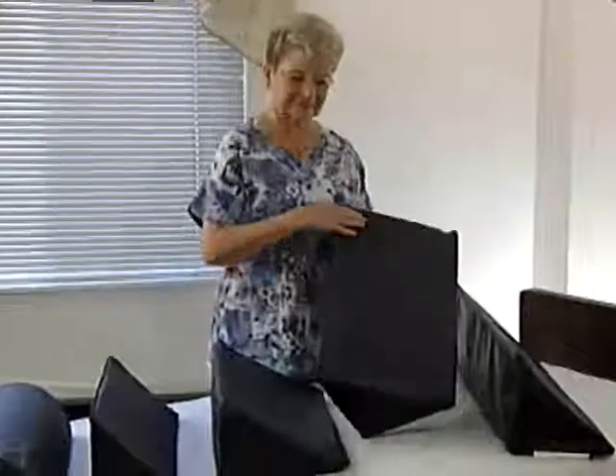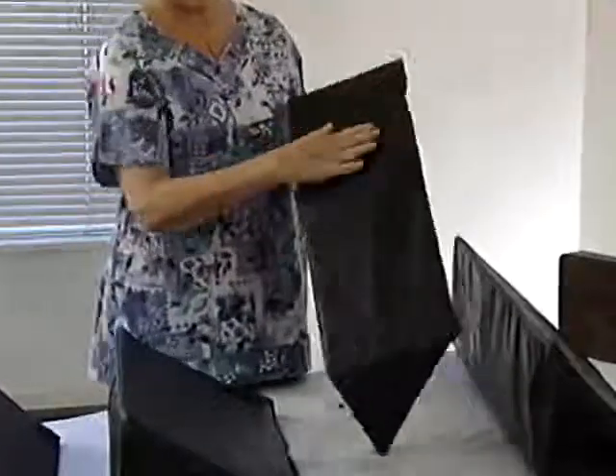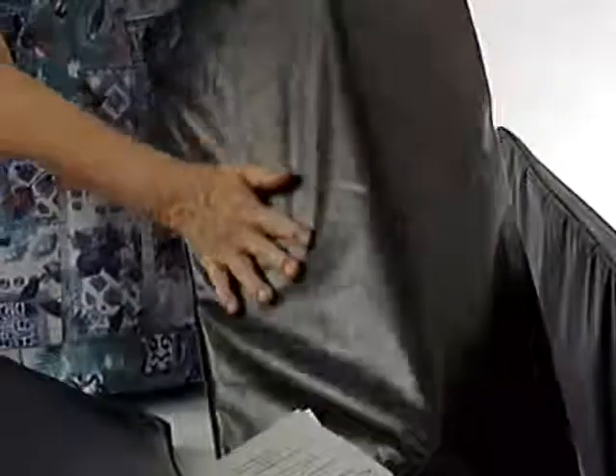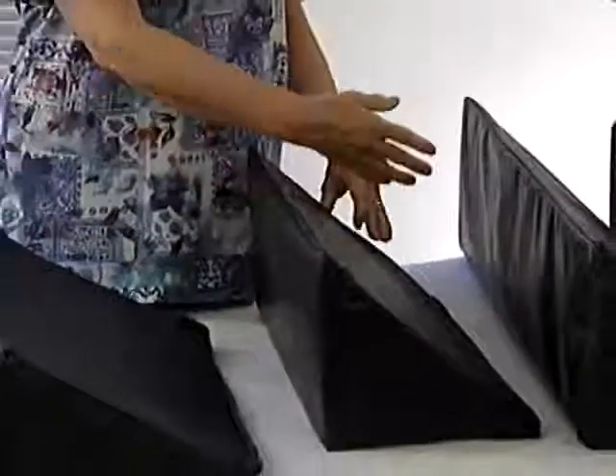These trunk positioners have a patient side, which is a dark blue material called rip-stop nylon. The other two sides are covered in black non-slip vinyl. The patient side is slippery and the bed side is non-slip. Both materials are latex-free, antimicrobial, and impervious to fluids.